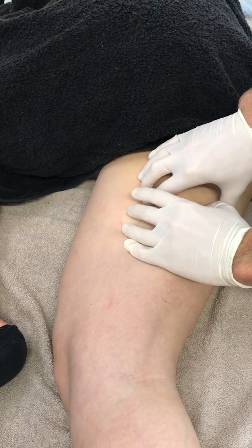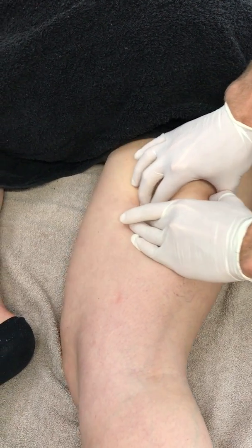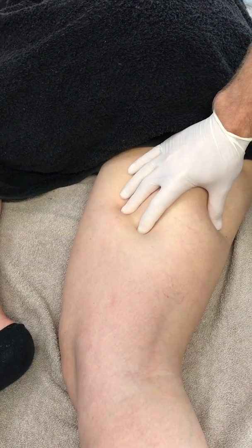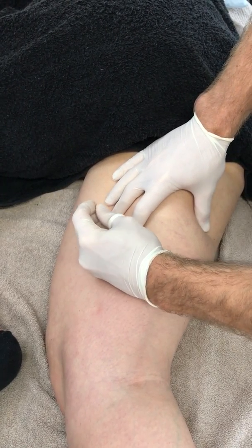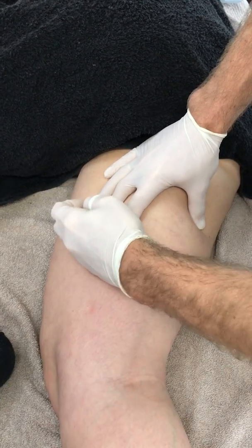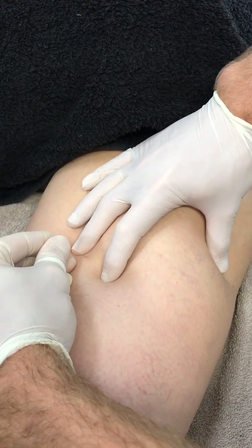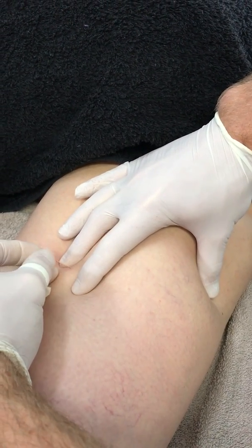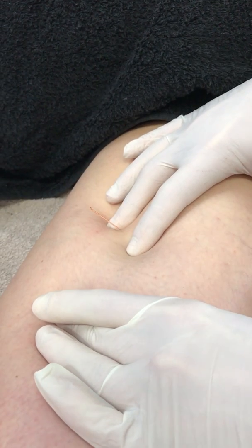Make sure you're not needling gracilis over the top. There's gracilis there, so push that up there. And there's adductor magnus there. So with where I'm needling here, I'm about halfway down the thigh. So theoretically the femoral artery should be in front. So we'll needle medially and tip it posteriorly. In this position, you can needle multiple points along here as well.